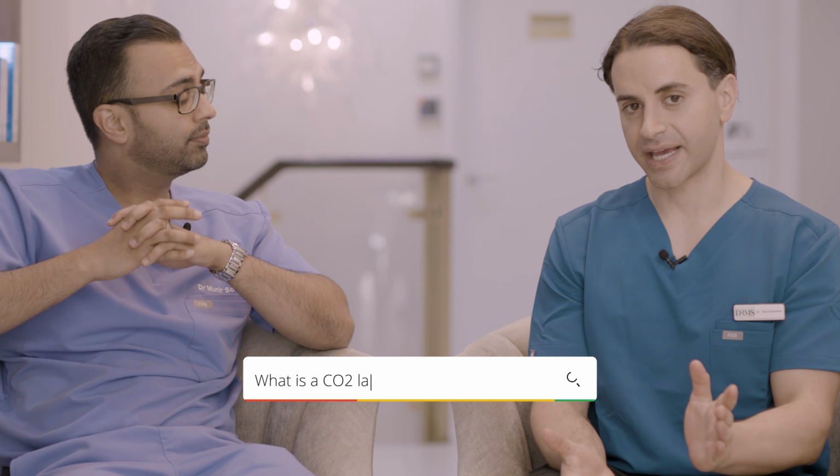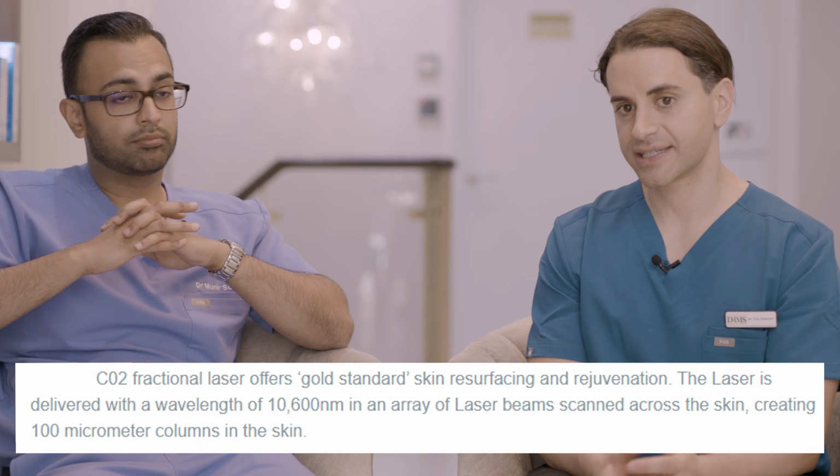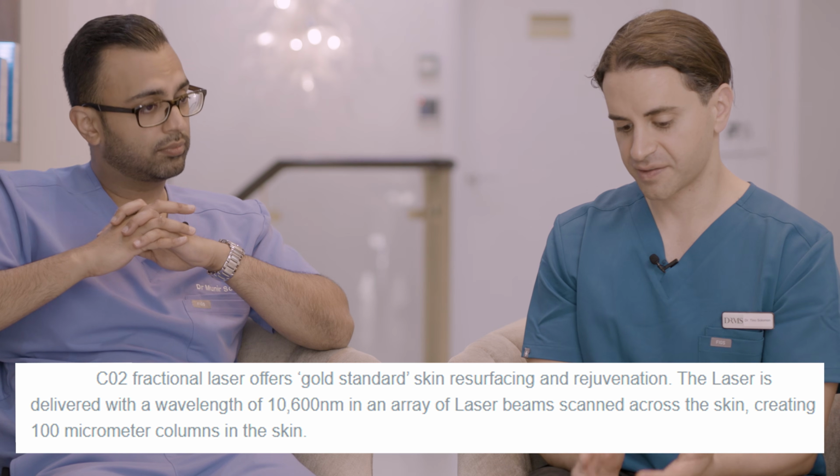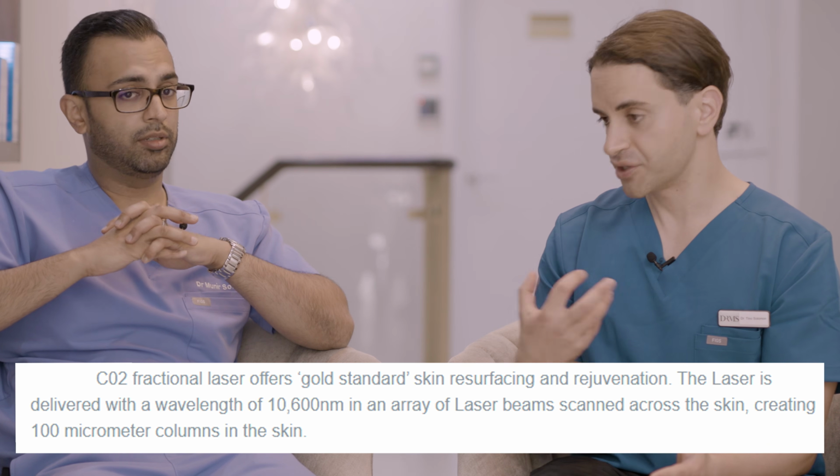Okay. So what is a CO2 laser? CO2 laser is an invisible infrared light that delivers energy in the form of heat. And that heat is used for certain treatments, resurfacing of the skin, ablation of the skin, and we use it to treat certain conditions, which we're going to talk about in this video.